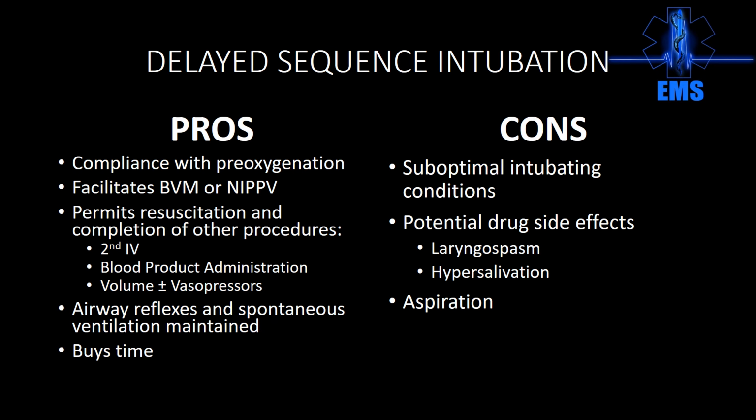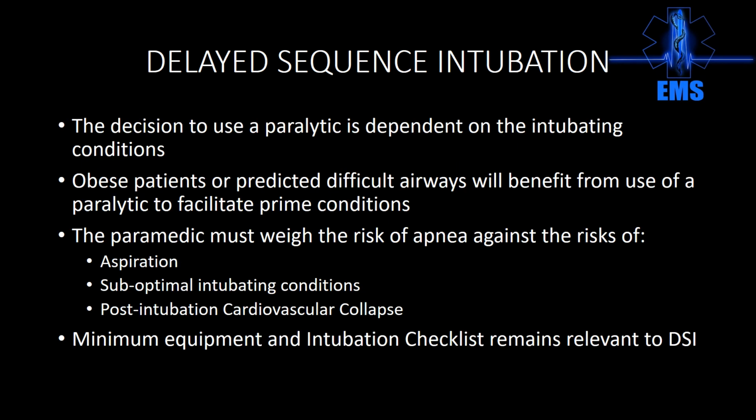The cons: a lot of people will say this gives suboptimal intubating conditions because you're not doing that bang-bang sedative followed by paralytic, so you have a decrease in the time. And if you do not paralyze the patient, you're not removing their glottic tissue tone, and that's going to interfere with your ability to intubate the patient. And there's always the potential for drug side effects, particularly with ketamine, which is hypersalivation and laryngospasm, both of which will complicate your ability to intubate the patient.